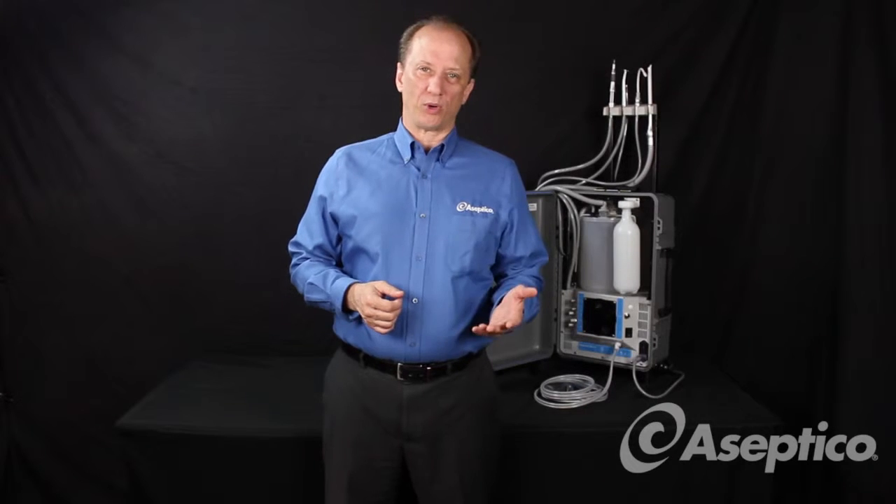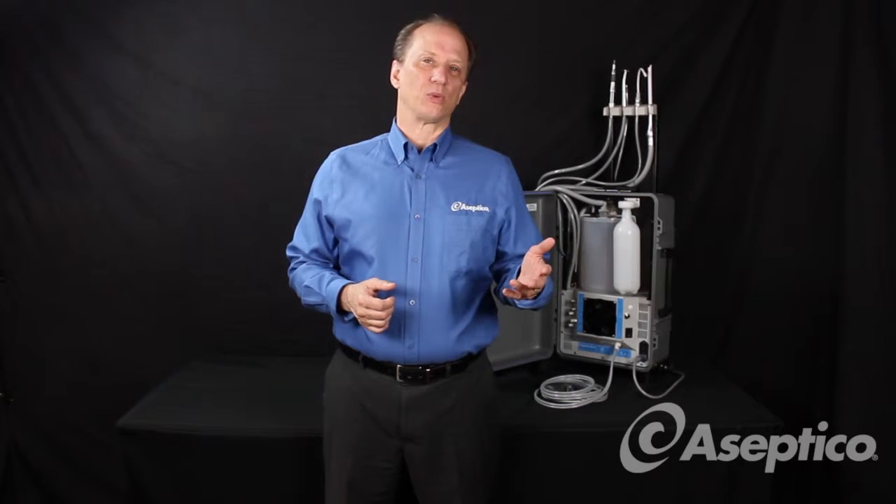Hi, I'm Jeff with Aseptico, and today we're going to be talking about how to troubleshoot your Express Portable Dental Unit in a situation where you might not be getting enough or any air or water to the handpiece.